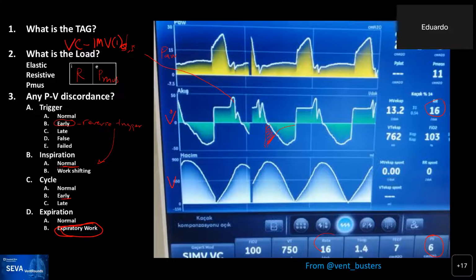And the algorithm to implement the dual in some of these will change across ventilators. So as we always say, you need to know what your ventilator does. And so this is just rough guidance, and we continue to discover things that we didn't know that the ventilators would do.